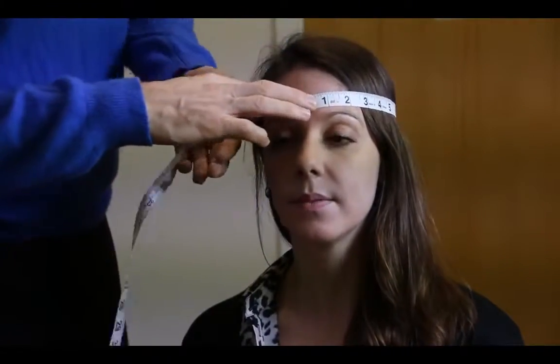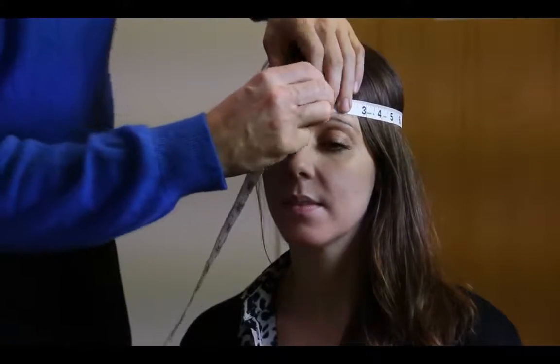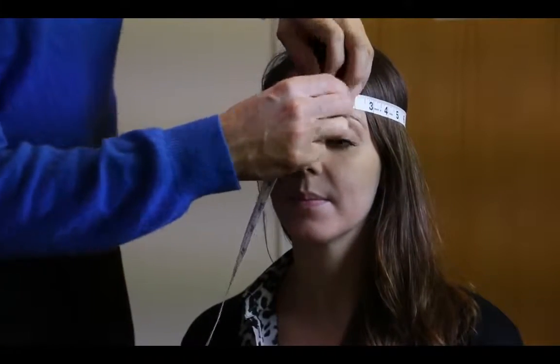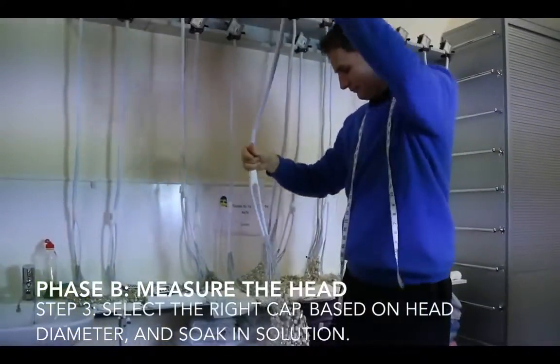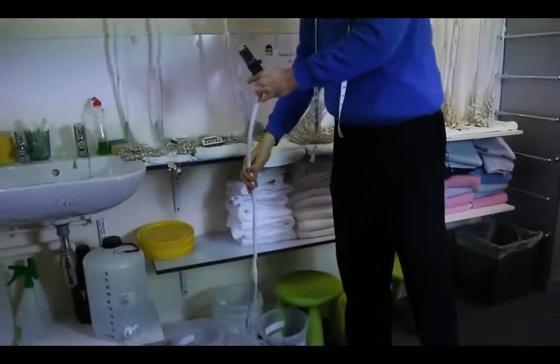The cap sizes in our lab are measured in centimeters. Once you've selected the correct cap, you're going to soak it in the solution you've already prepared. Set the timer to soak it for 10 minutes.